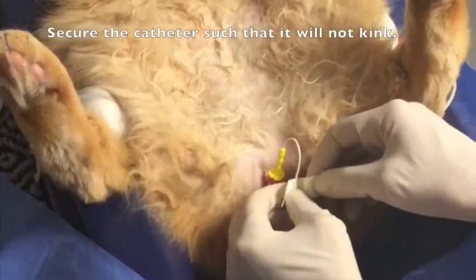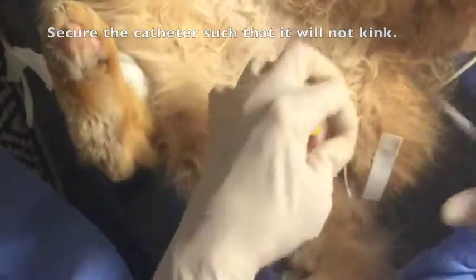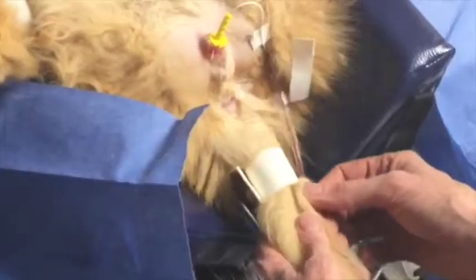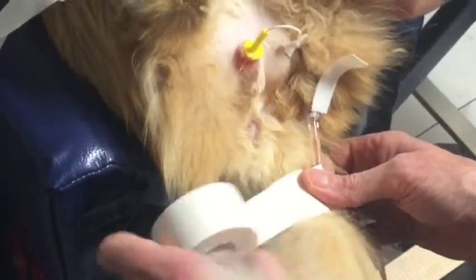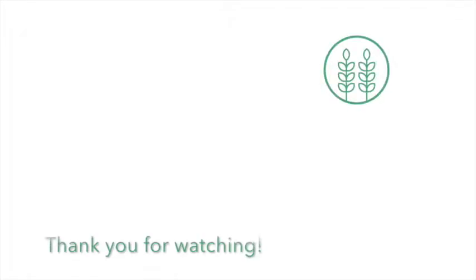Suture the catheter into place and further secure the catheter using tape to the patient's tail or leg. Indwelling catheters should be soft and flexible.